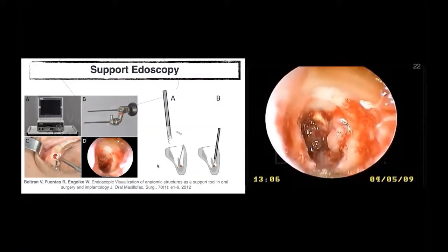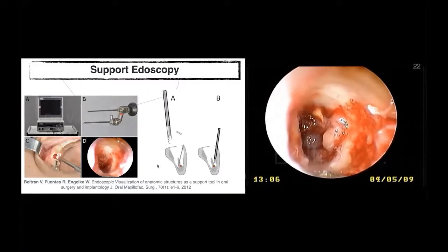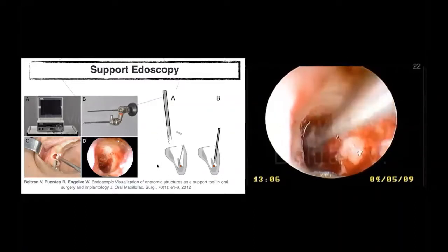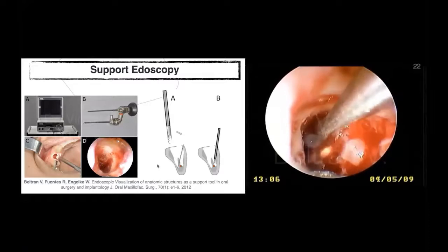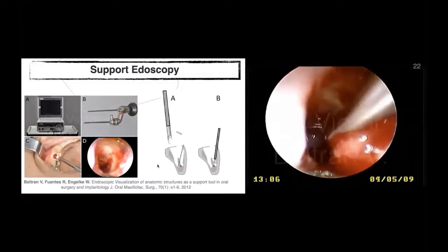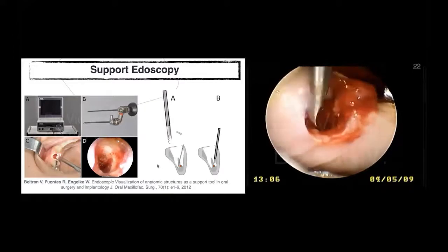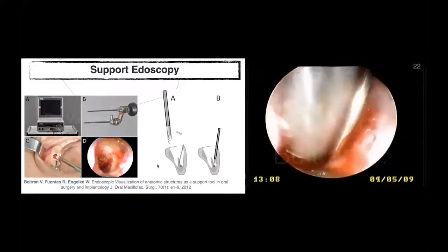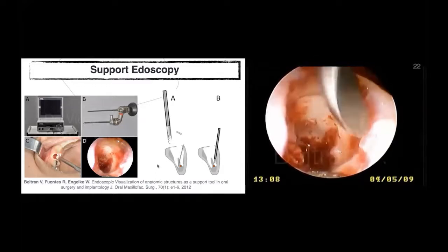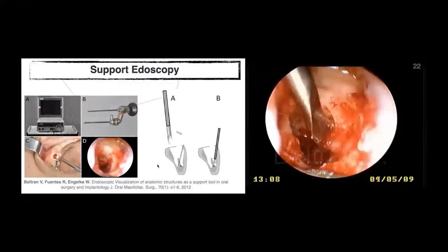After the root extraction, we can see a radicular cyst extending in the apical portion, adhered to the bone wall. Then we use a Lucas surgical curette to remove the granular tissue under endoscopic control. This way, we are able to remove pathological tissues and root fragments within the dental socket with precision, aided by magnified visualization. This is very important to ensure the implant is placed in a socket which is free of pathological tissues, and this way avoid failures during the osseointegration period.